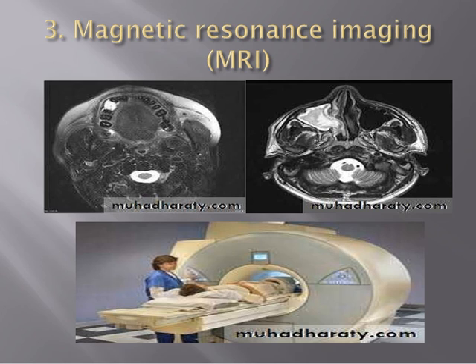In magnetic resonance imaging examination, a patient is placed in a powerful magnetic field in which the protons within the body become aligned longitudinally when applying a radio wave, a radio frequency.